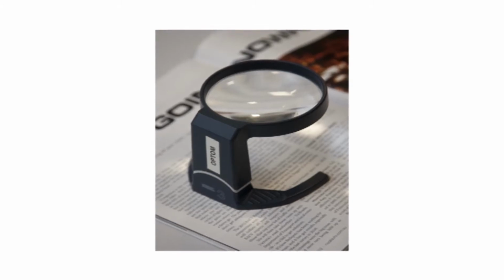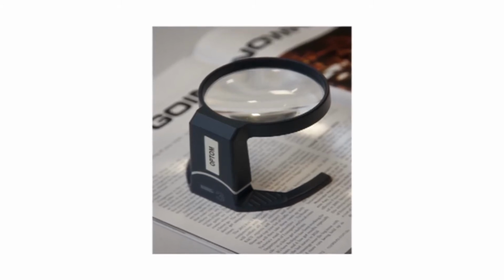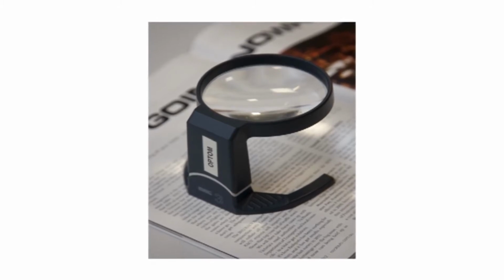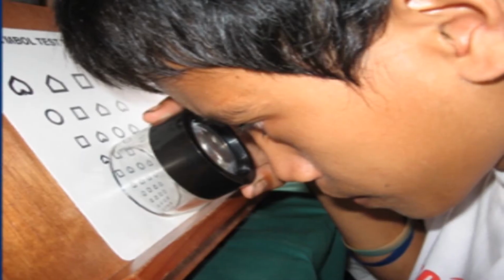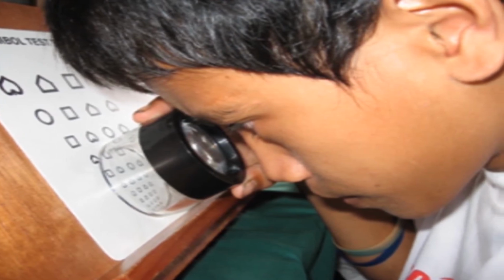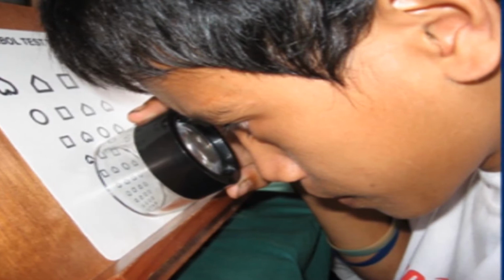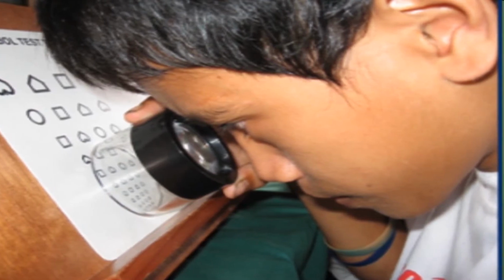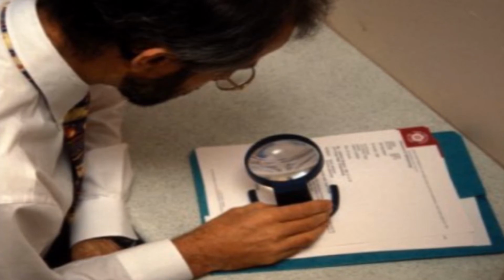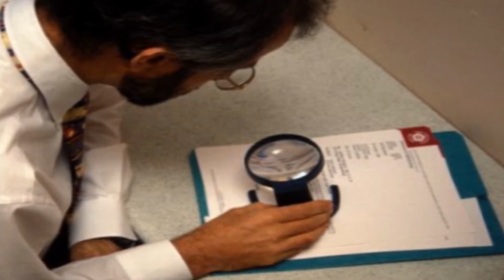Stand magnifier. The next optical device is the stand magnifier, where a high power lens is mounted on a strong plastic stand. It is useful for children as it has a fixed focal distance. Children with low vision will get a comfortable posture if it is used along with a reading stand. This is useful to the person who has difficulty in finding or maintaining the correct distance.